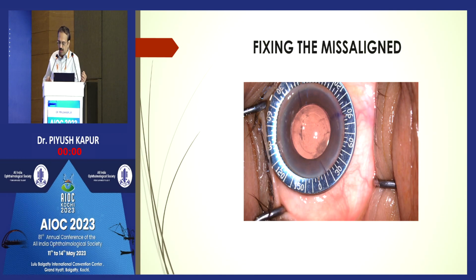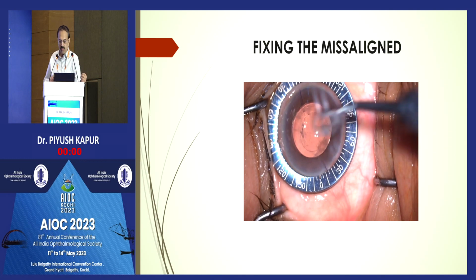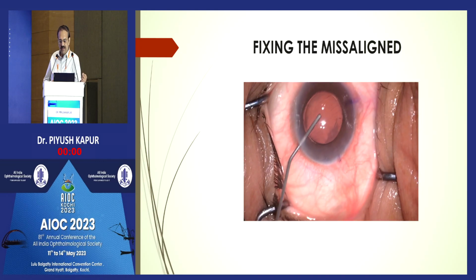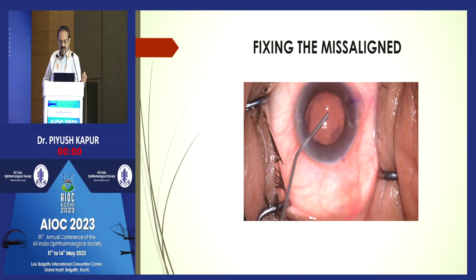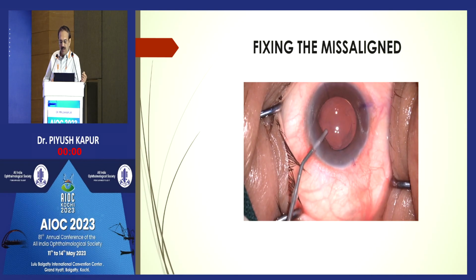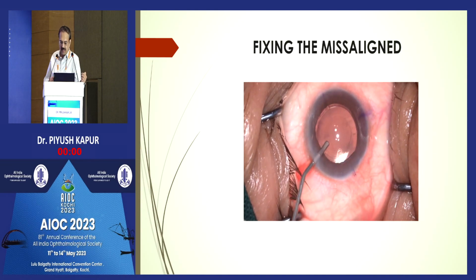When I went back to look at the data of this patient, the optometrist who had calculated the K values and given them for the toric alignment had just reversed the 180 and the 90, and we landed up with the lens placed accurately, but at a 90-degree misalignment. This was 2 weeks post-operatively, but we went and realigned the lens by lifting the rhexis margin a little, because the capsule gets adhered to the margin of the lens, and injecting a little viscoelastic in the bag to separate the lens from the capsular margins.